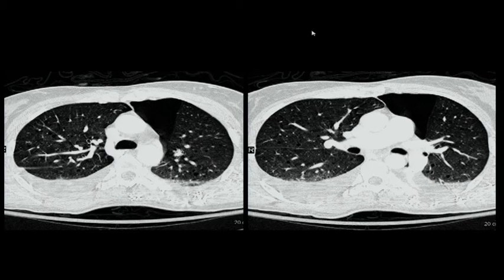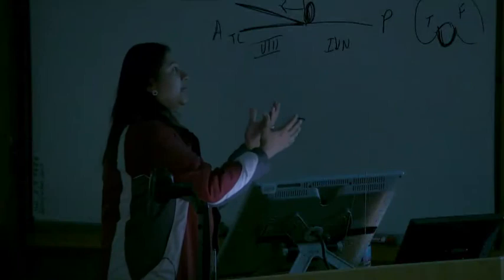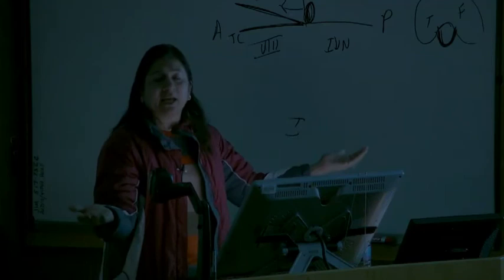Okay, let me look at this. Let's look at this cyst over here. Does it have a pulmonary artery associated with it? No. Do we see any more cysts, especially here? Now you see, now what is the diagnosis? Okay, open to the house. LAM. We all get coffee. We just spoke about that. Young patient presented with acute chest pain. Cysts and pneumothorax cannot be anything else but LAM.